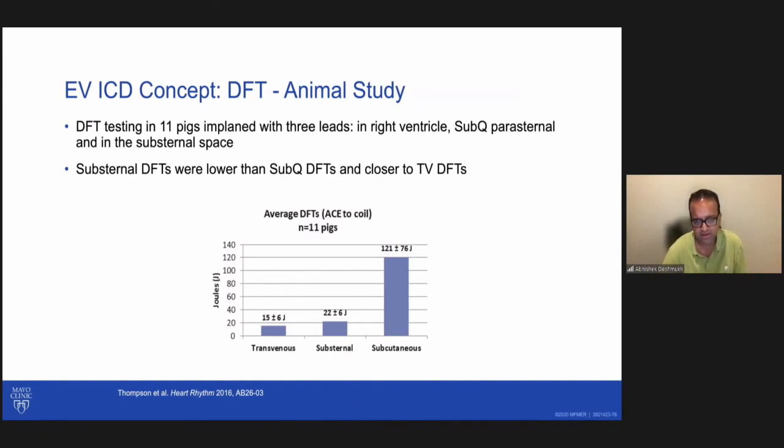Now, with this, in addition, you have pacing capability, anti-tachycardia pacing. It does appear that this could be one of those devices which might get popular in the next few years once it gets approved. So certainly has its own unique advantages. Implant procedure is still quite tedious and arduous. And at least for the first few cases, what we have done here, we had a cardiac surgeon in the room to help us in case we have a problem doing these cases.